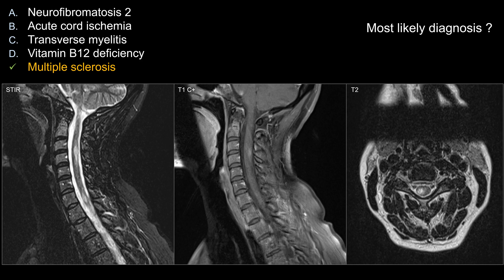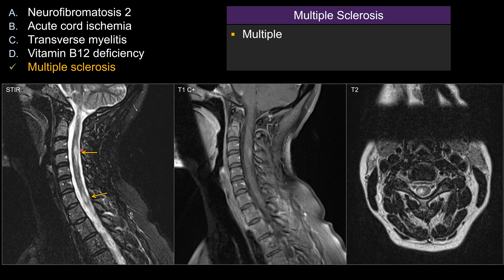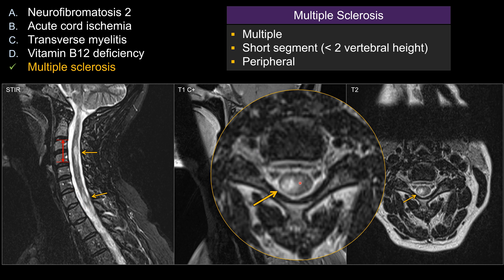The correct diagnosis is choice E, multiple sclerosis. Let's look at some of the image features to make MS the best choice among these five answers. The lesions are in the periphery of the spinal cord rather than central. As you remember, the periphery of the cord is where the white matter is, and the central is gray matter — kind of a flip of what you see with brain MR. So: multiple lesions, short segment, peripheral in location — that is fairly classic for an MS lesion.